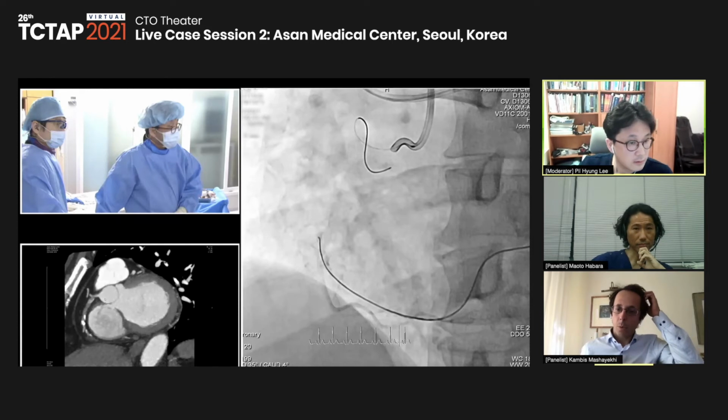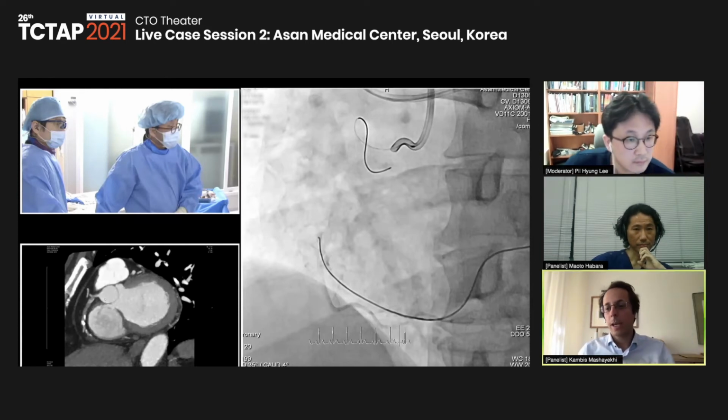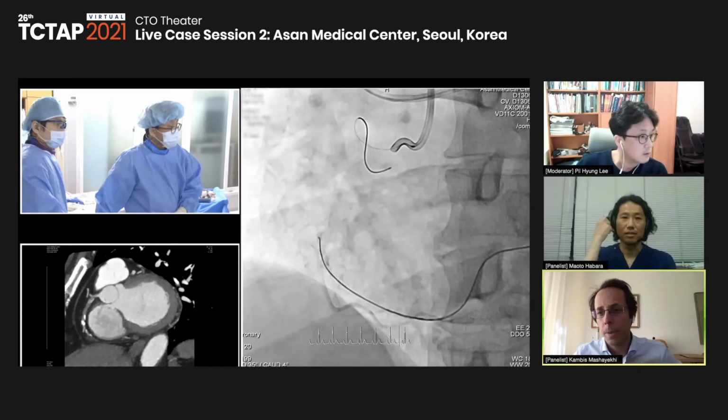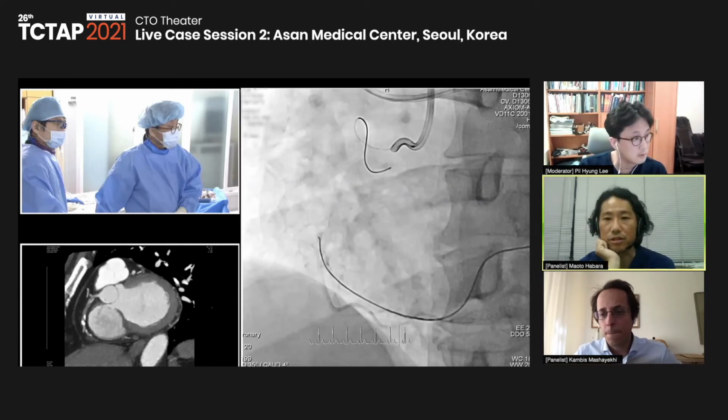And I think one important thing also is, whenever you tackle this kind of epicardials, because it's not only the experts doing this nowadays, it should be really important to have the coils right in place. So which coils are you using, or which do you have in your lab, if this epicardial rupture? So what would you use for coiling it? Of course, we use C stopper.